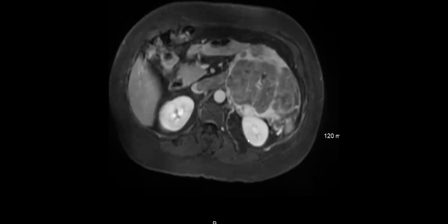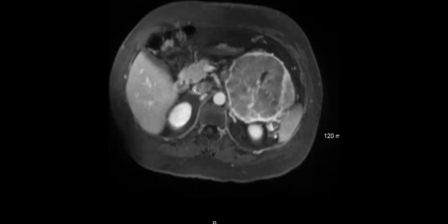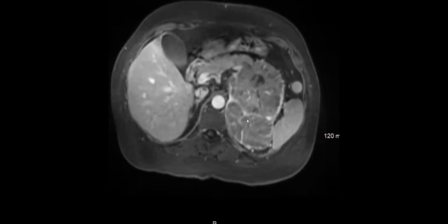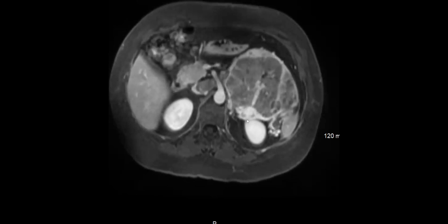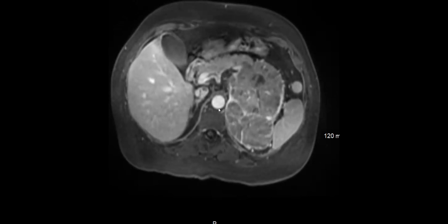Yes, exactly. And do you see any other finding on this particular post-contrast image? There's like tumor invasion on the vein. Yes, bingo, Nelly. So there is, as you can see here across the midline, there is a tumor thrombus from the adrenal vein going into the IVC. So, based on their symptoms, initially, I was thinking this might be a malignant pheo, or of course, ACC because of the calcifications, as you mentioned rightly, Aarti.